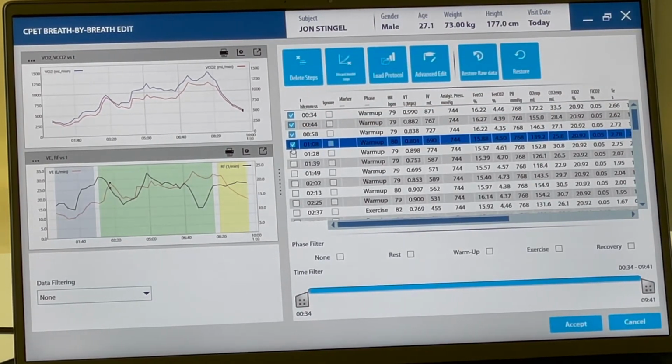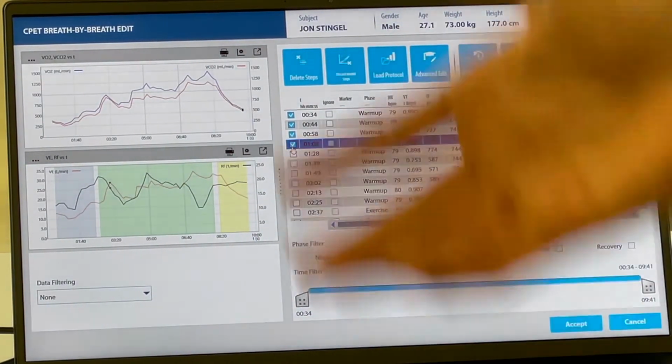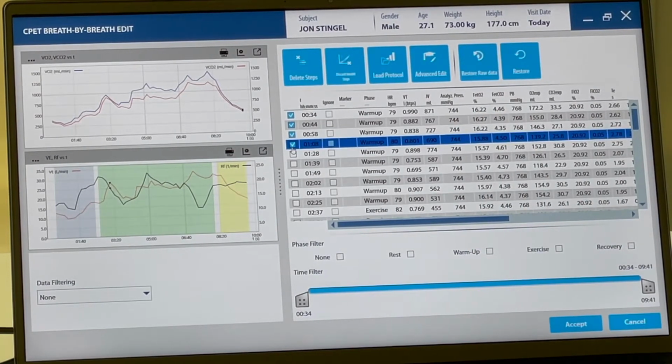That's pretty much it, because it sounds like you guys are going to be exporting everything. So just make sure that you save it and export it as raw, and then if you want to filter it, come back in, filter it, export it again, and then you have your raw Excel and your 30-second average Excel. Just so you don't have to manually do any averaging in Excel on its own, you can have the two.